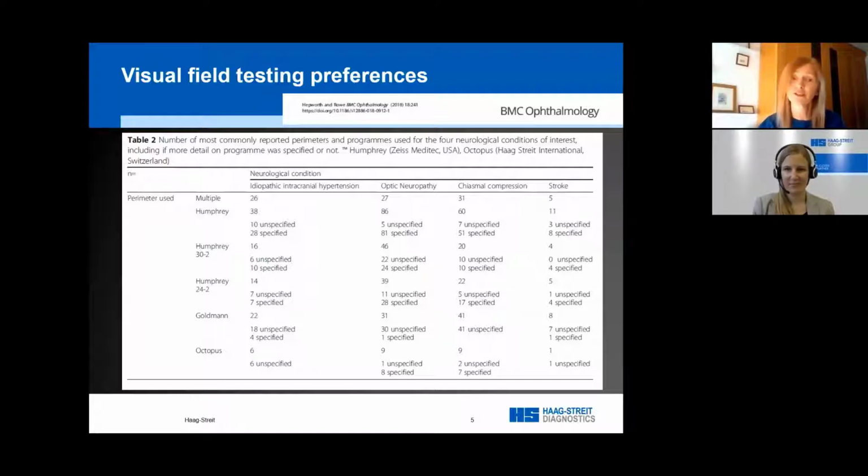So further research is now ongoing to evaluate this further, and we wanted to find recommendations for testing in neurodisease that is informed both by the condition as well as the related visual field defect patterns, and not simply by familiarity with just one specific program type. Which, of course, from a practical point of view, makes a difference, right?